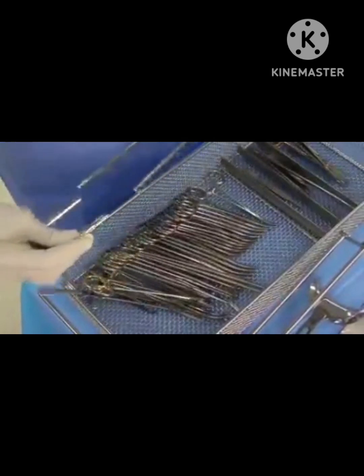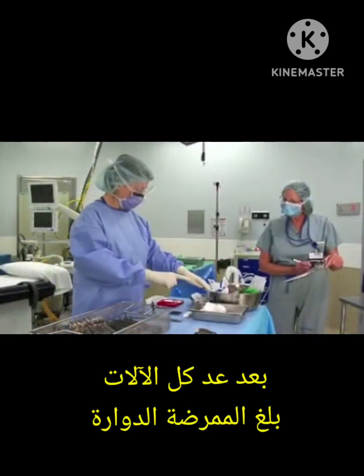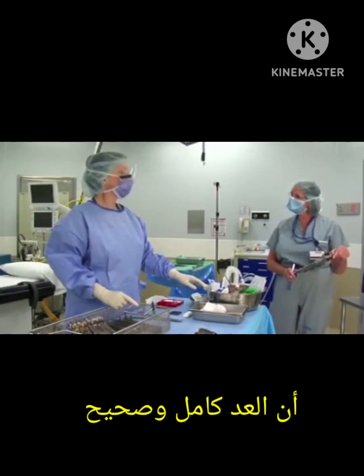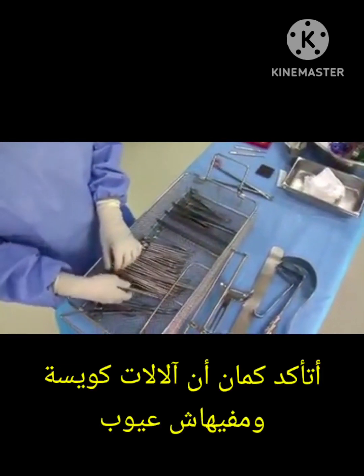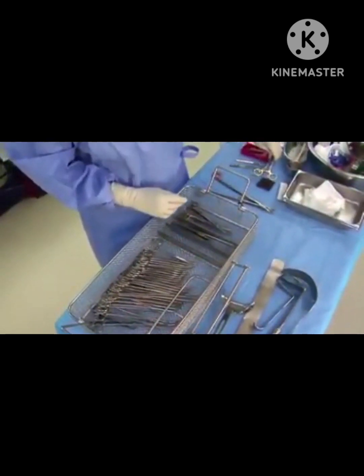When all instruments are counted, remove the stringer to release the instruments. Depending on hospital policy, the stringer may be counted and kept on the back table or passed off. When you have counted all items on the back table, notify the circulating nurse that the count in is complete. Inspect all instruments for cleanliness and function, and remove any items that do not meet these criteria from the sterile setup, but ensure they are not taken out of the operating room suite.